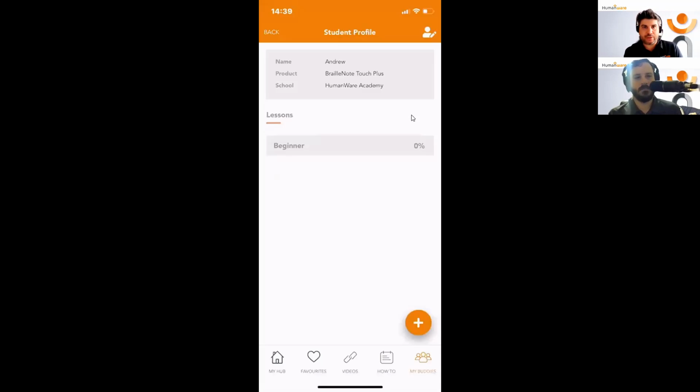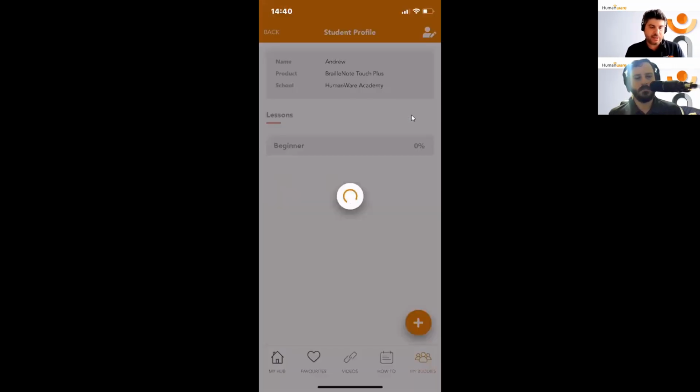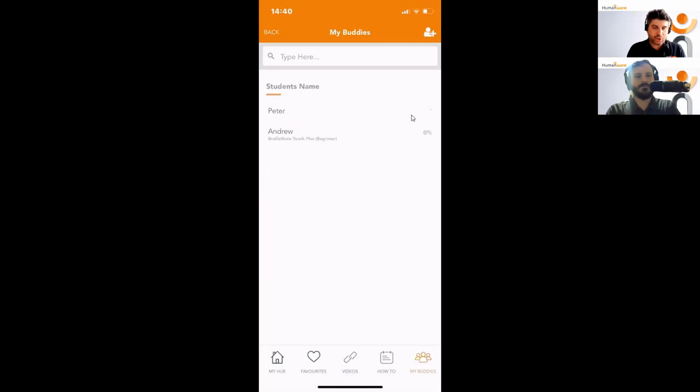And that's my lesson created for Andrew. So let's take you back to that very home screen again, just in case we ever get lost in this application. I'm going to go back to MyHub and choose My Buddies. Now in My Buddies, I will have, of course, my Andrew and Peter. I've got Peter, there's Andrew. I'm going to click on Andrew.